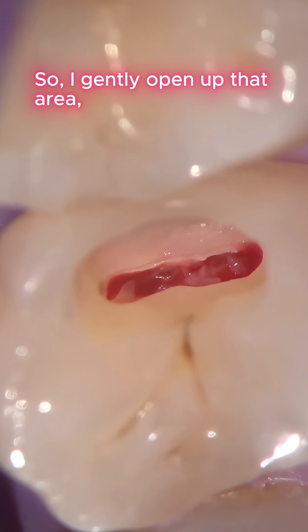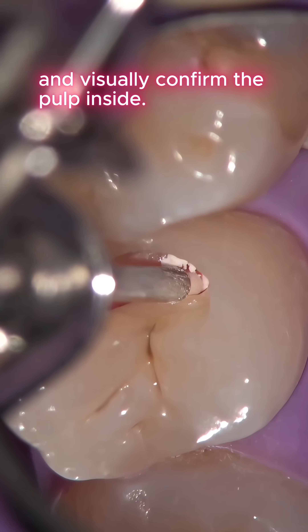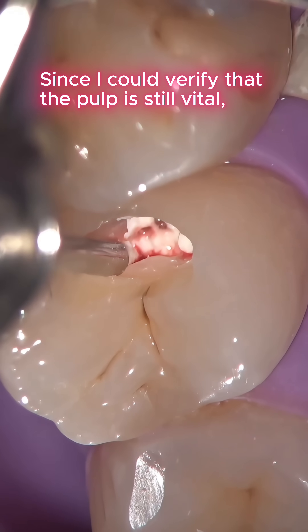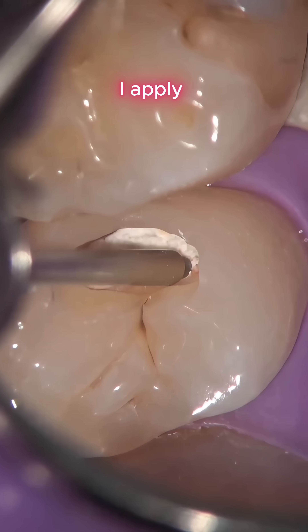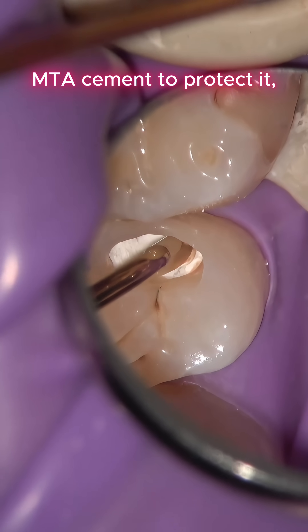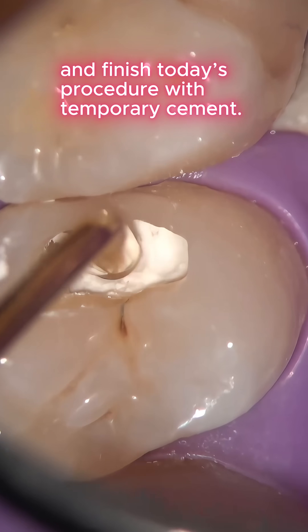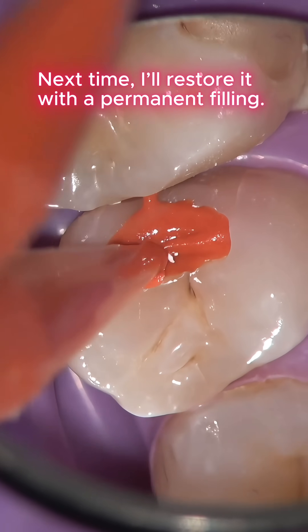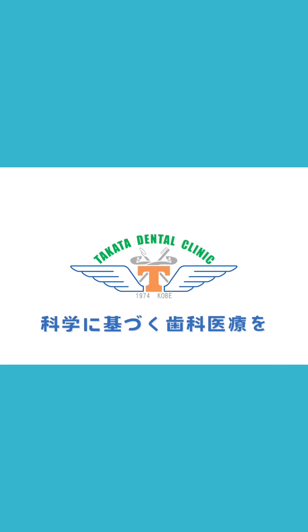I gently open up that area and visually confirm the pulp inside. Since I could verify that the pulp is still vital, I apply MTA cement to protect it and finish today's procedure with temporary cement. Next time, I'll restore it with a permanent filling. Science-based dental care — Takata Dental Clinic.